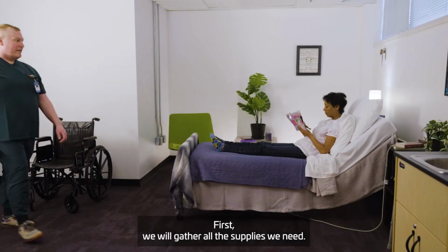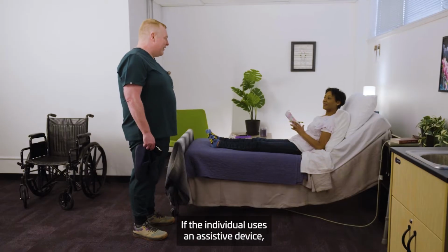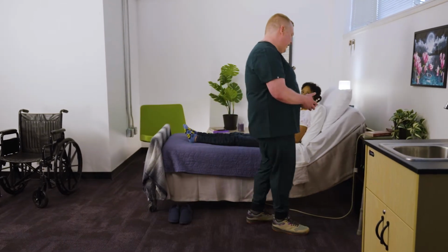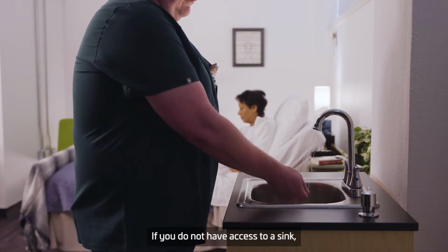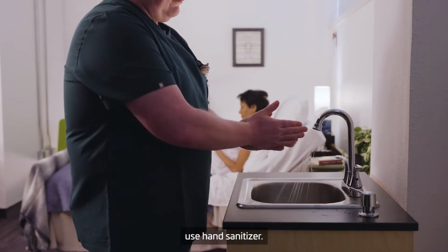First, we will gather all the supplies we need. If the individual uses an assistive device, place it near the bed with their shoes and, if applicable, a gait belt. Always wash your hands before touching the individual. If you do not have access to a sink, use hand sanitizer.